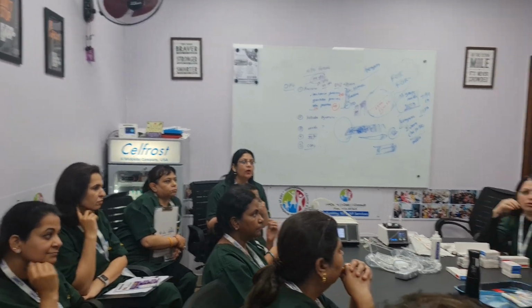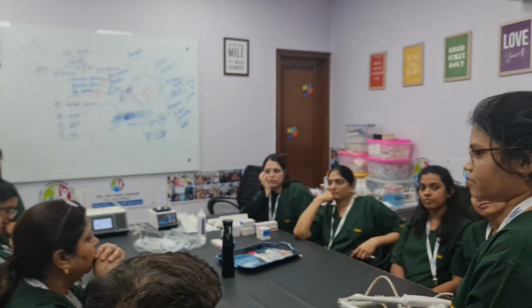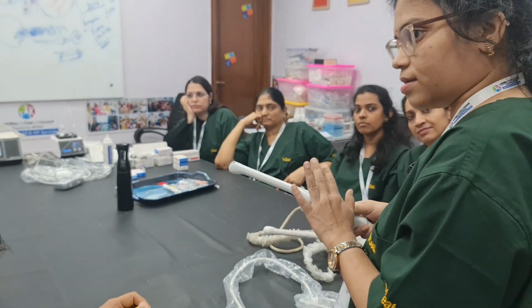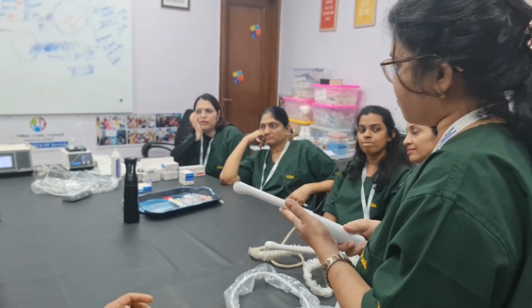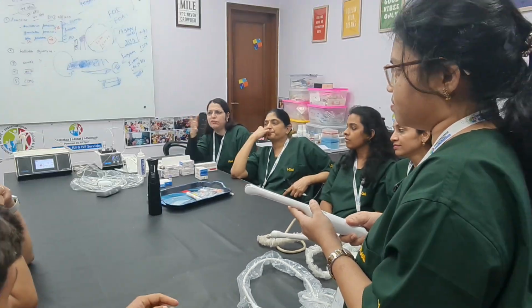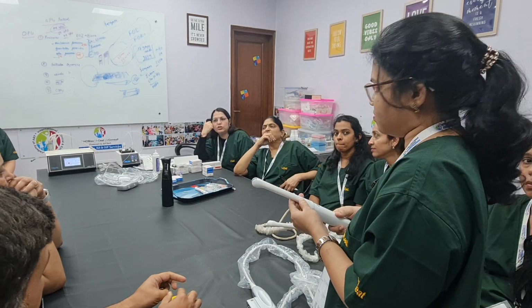Okay, thank you. 3D is very good to diagnose Mullerian anomalies. It is the coronal view; we get the coronal view from the 3D. The sagittal and the axial views can be better seen in 2D. We can get everything from 3D, Mullerian anomalies basically. 2D we can do with 3D, in addition to the coronal.